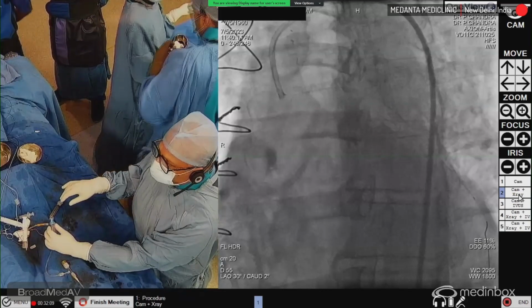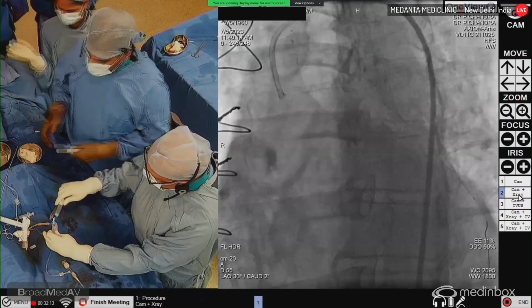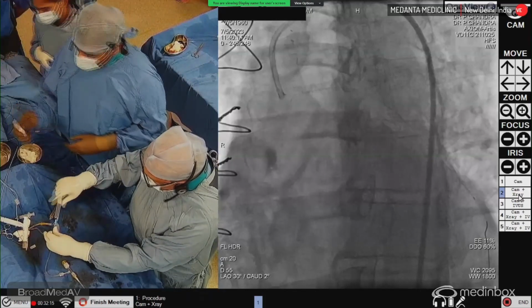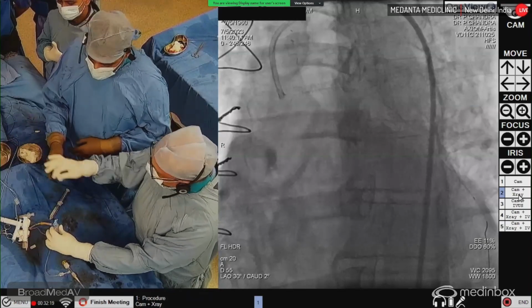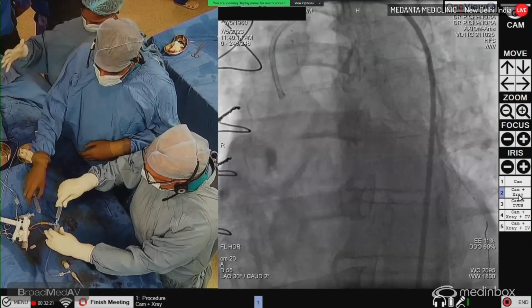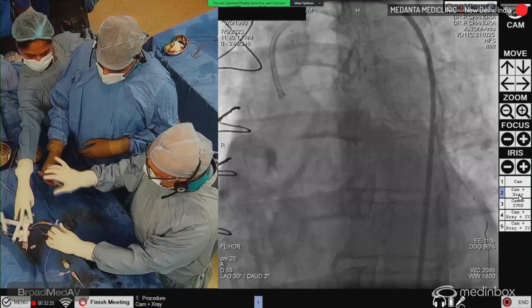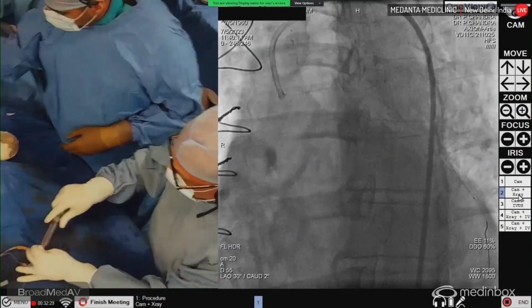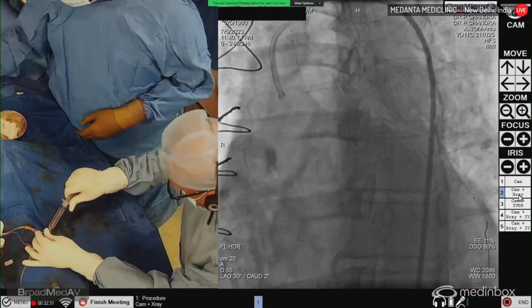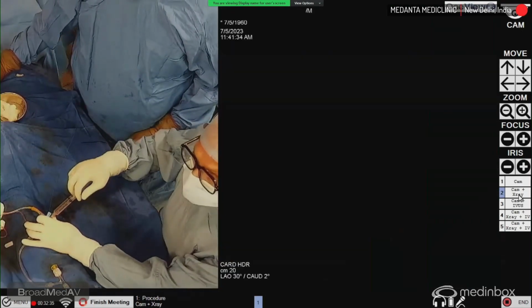Okay. This is diltiazem. Yeah. This is nicorandil. Okay. Nicorandil. So everything is in, and now we can take a shot.